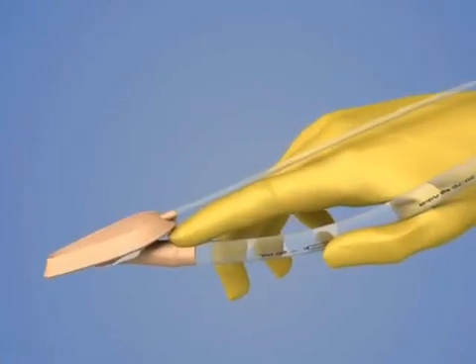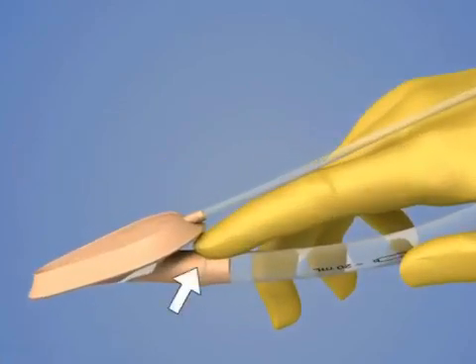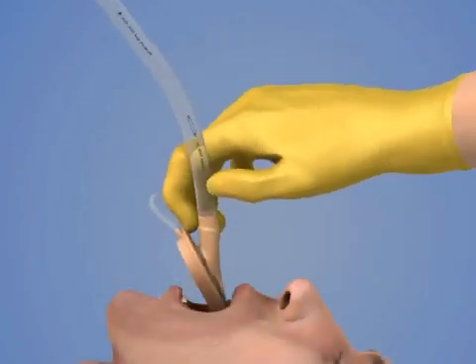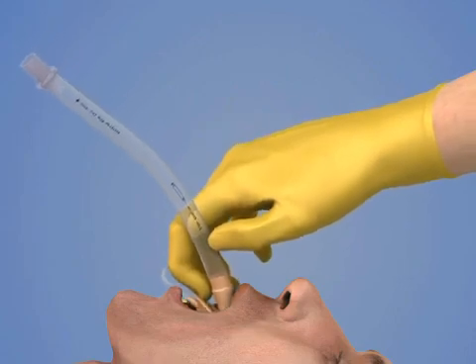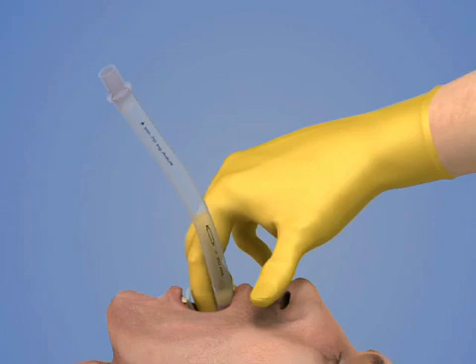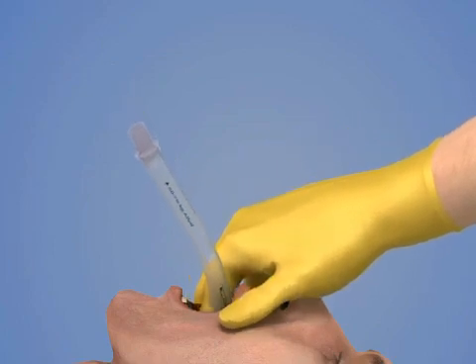Hold the LMA like a pen with the index finger at the junction of the airway tube and the cuff. Insert the LMA into the mouth and use your index finger to slide it along the hard palate and into the oropharynx. Continue advancing until resistance is encountered in the hypopharynx.